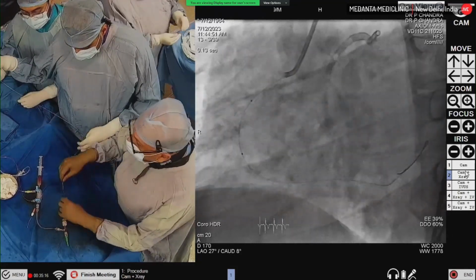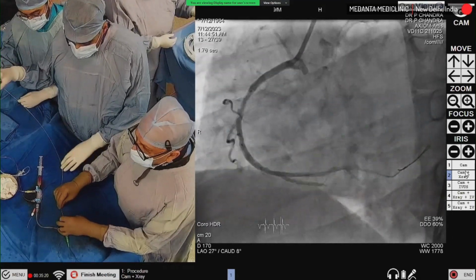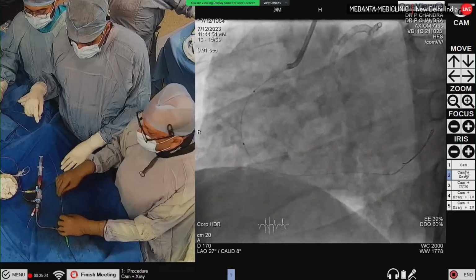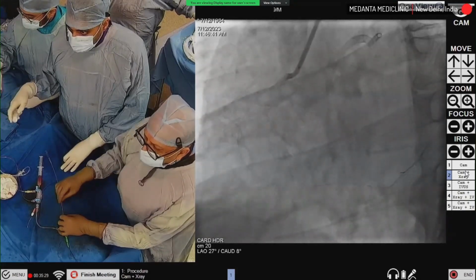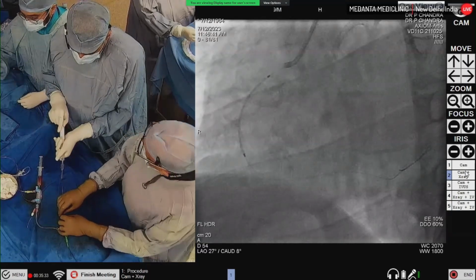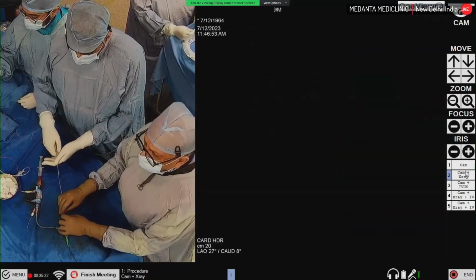Okay. So this is 3.0 38. Okay. And this is Zines Alpine. Zines Alpine 3.0 38.